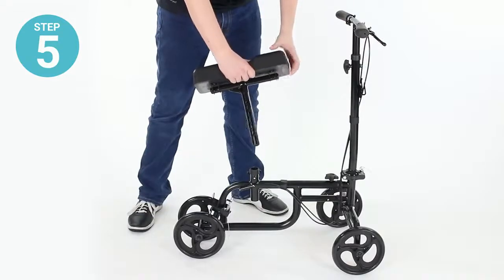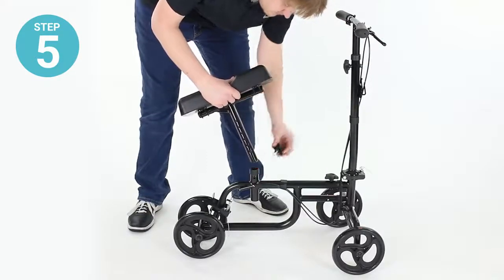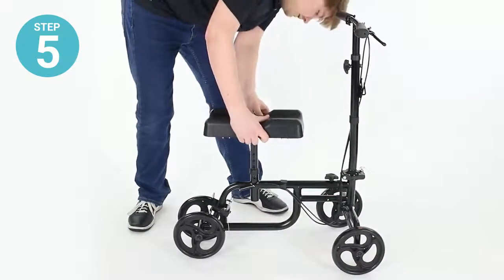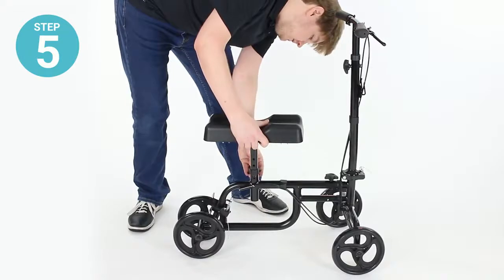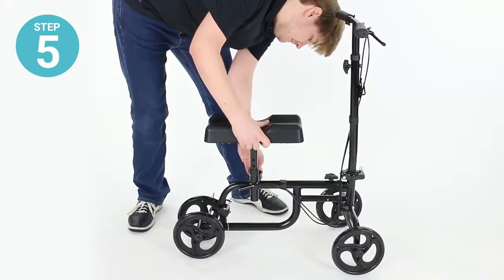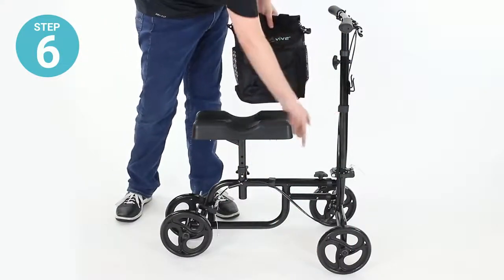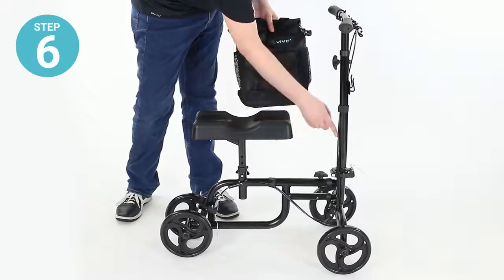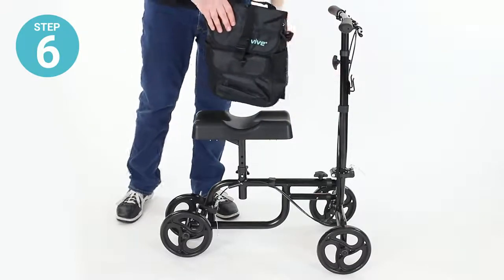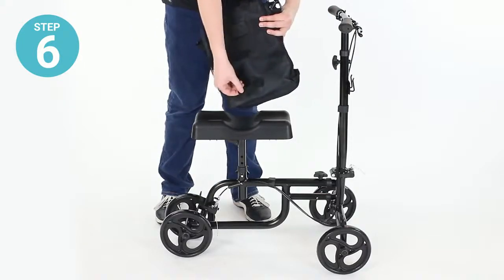Step five: install the seat into the socket on the bottom of the frame. Remove the bolt, fit the seat in place, and secure back down tightly. Step six: make sure that the velcro straps are securing the brake lines down, and attach the bag to the hooks on the steering column using the strap loop and the velcro straps.